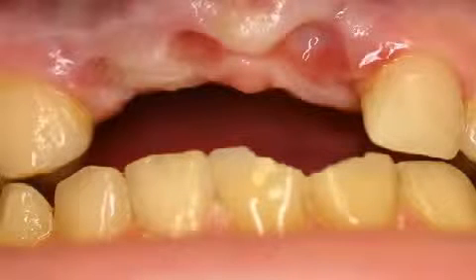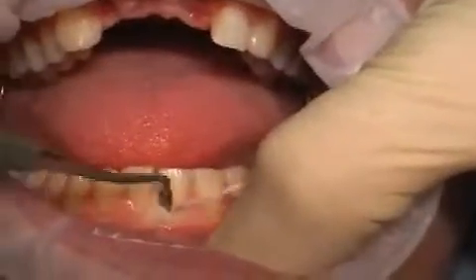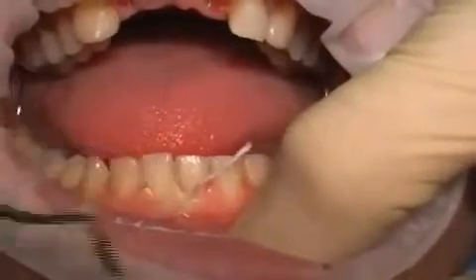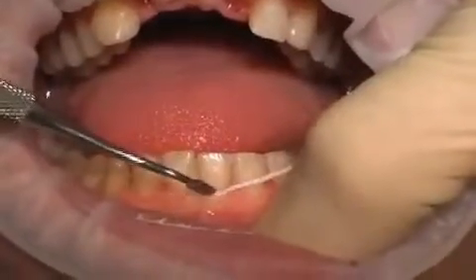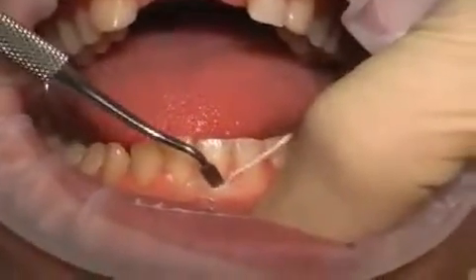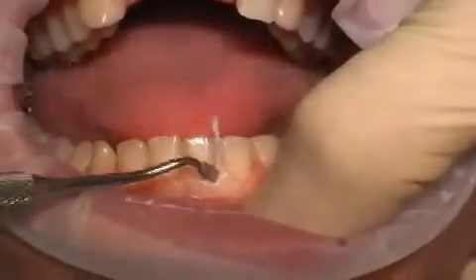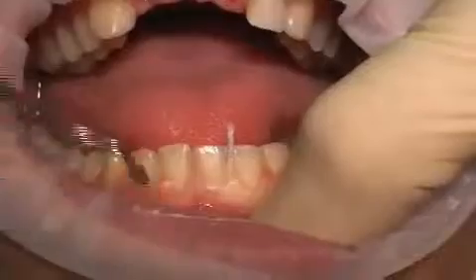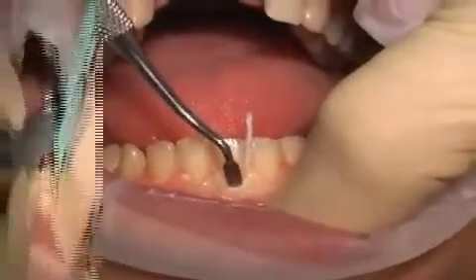The first stage in the veneer application process is the planning phase, often called a wax-up. During the actual preparation, a thread is laid first so that the gums do not get hurt during the diamond grinder sanding process. Receding gums would be the consequence. Furthermore, it is the only way to obtain attractive preparation borders during the tooth impression. There will be more about that in the video entitled Impression.